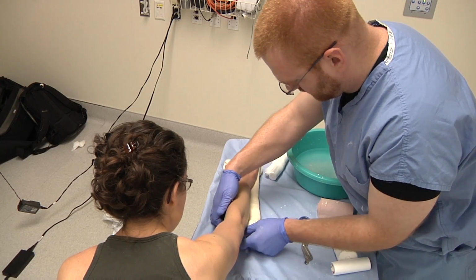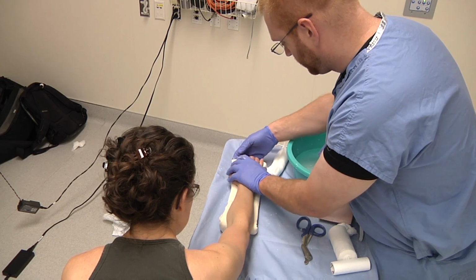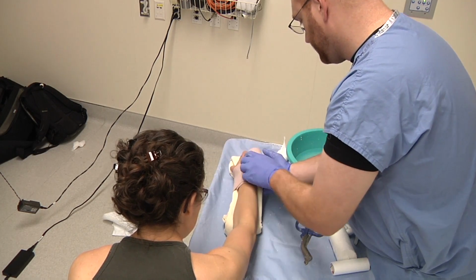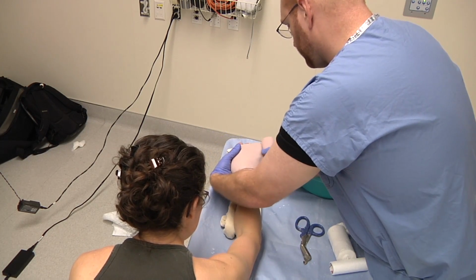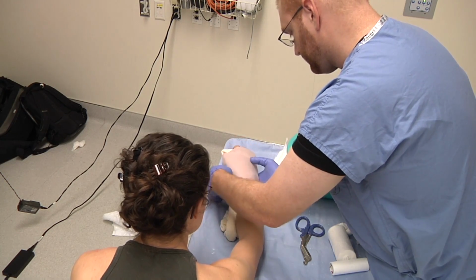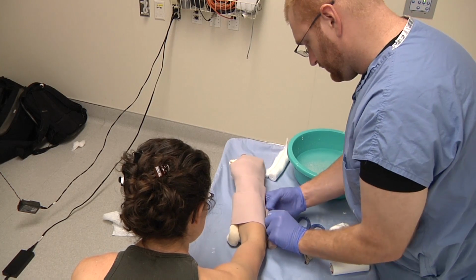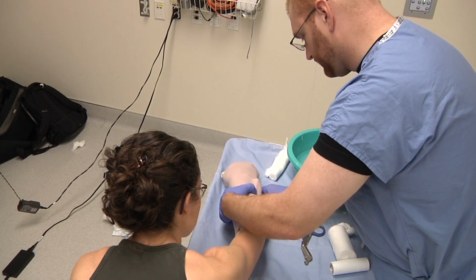Doesn't really need to extend down the arm, so you can easily fold things back away from the patient. Area for the thumb. And then, as this is generally done in the setting of infection or for comfort for the patient, just loosely apply an ace wrap to hold it in place. Don't be over constrictive with your ace wrap.